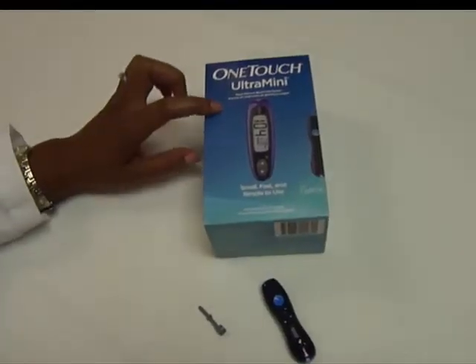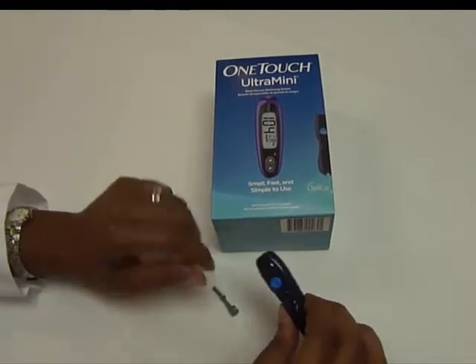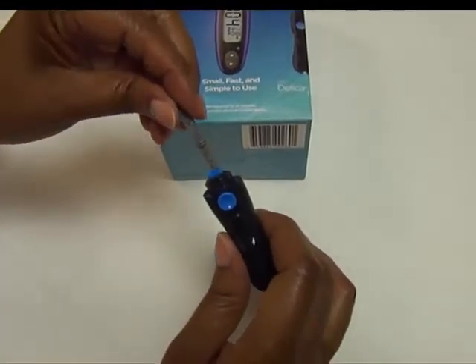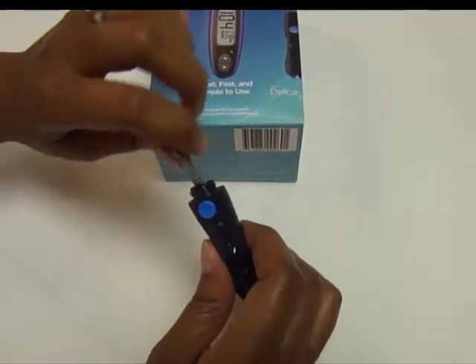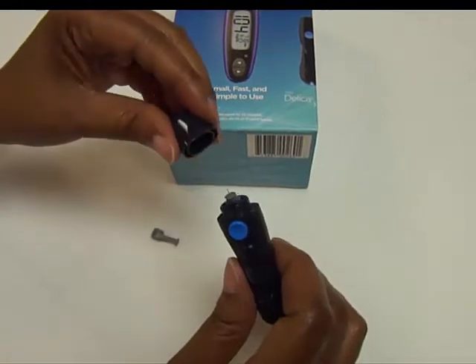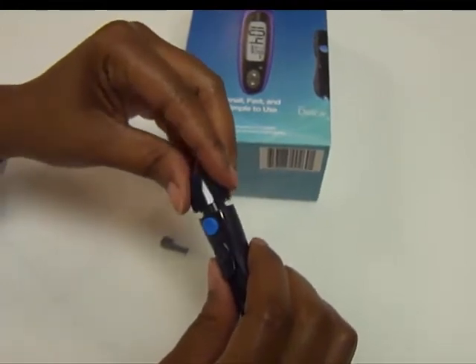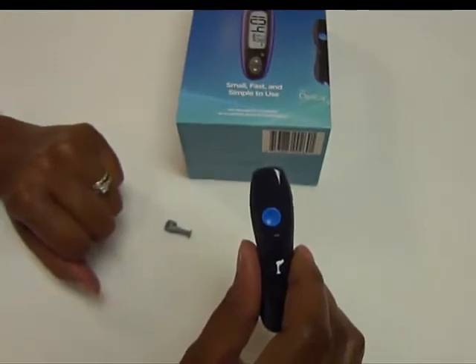This is the OneTouch UltraMini. This is the lancet device, and this is the lancet. I'm going to take my cap off. I'm going to load the lancet straight in until I hear it click, and I'll twist it off. And I'm going to put my cap back on, and I'm ready for my finger stick.